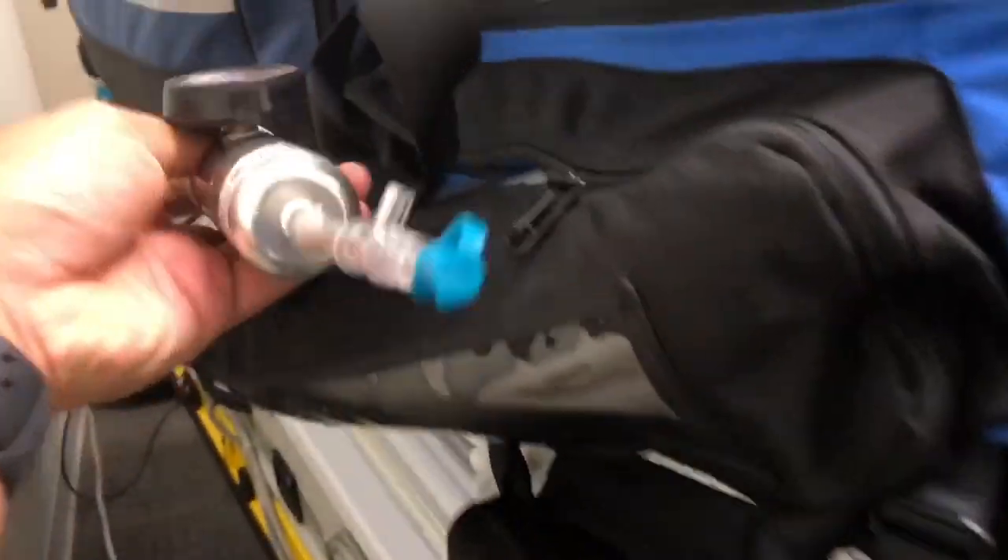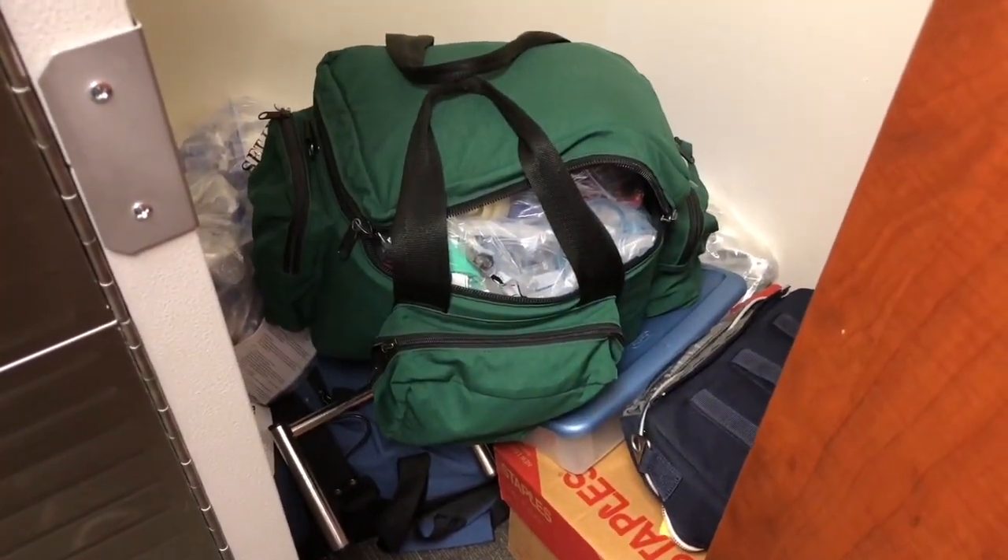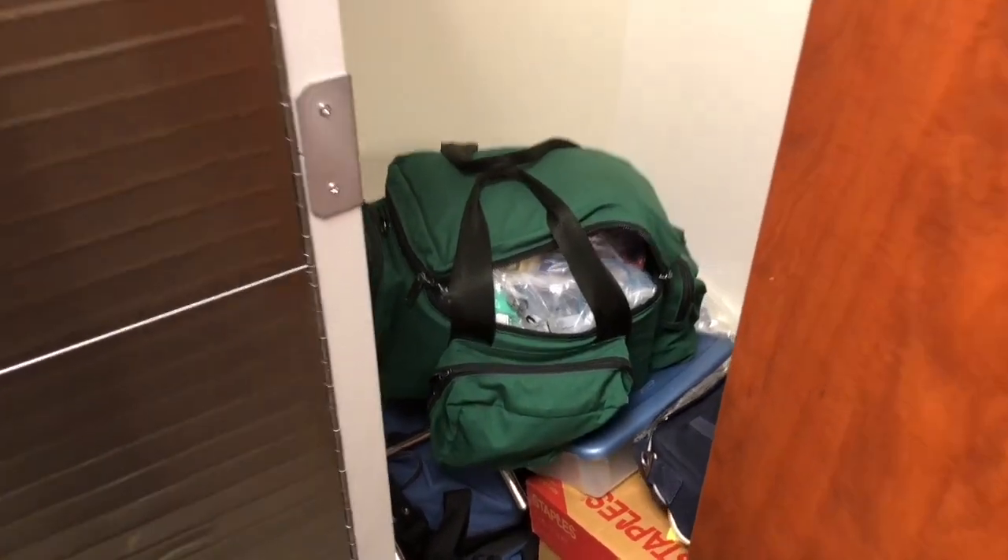The regulator will be on the top compartment of your transport pack. There's a practice kit in this bag, so if you want to take it out and set it up, you're more than welcome to.